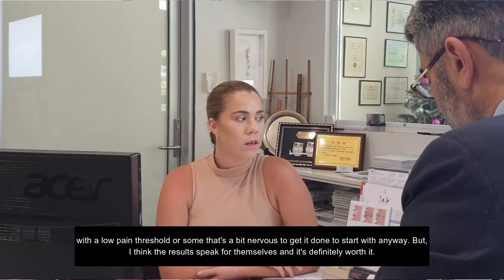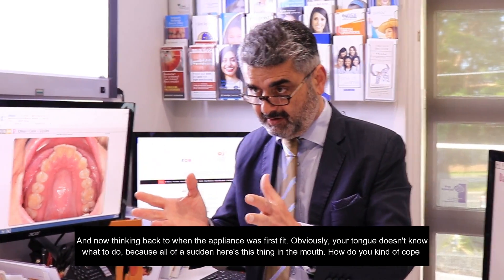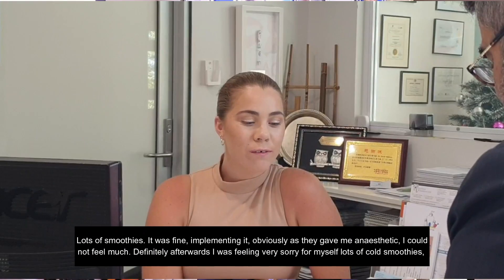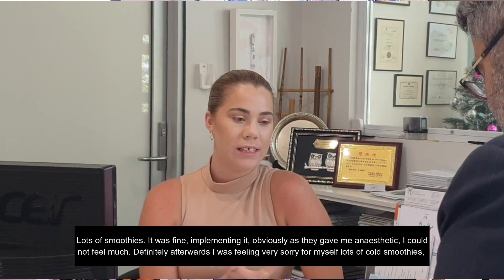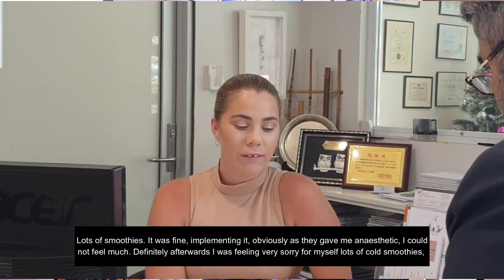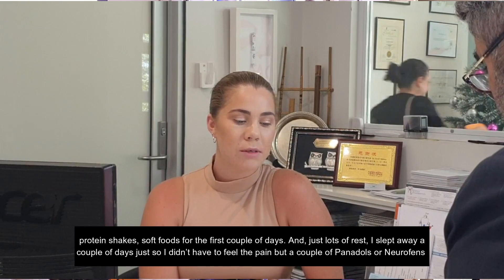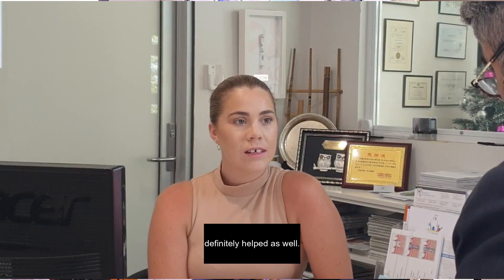But the results speak for themselves and it's definitely worth it. Thinking back to when the appliance was first fitted, obviously your tongue doesn't know what to do because all of a sudden there's this thing in the mouth. It was fine implementing it — I obviously had a local anaesthetic so I couldn't feel much. Definitely afterwards I was feeling very sorry for myself: lots of cold smoothies, protein shakes, soft foods for the first couple of days, and just lots of rest. A couple of panadols definitely helped as well.